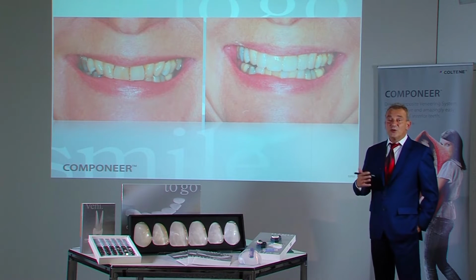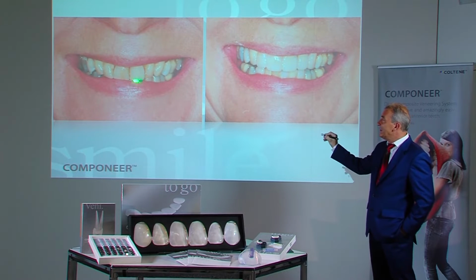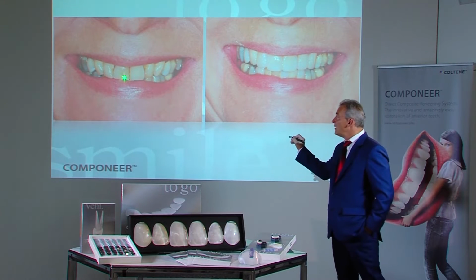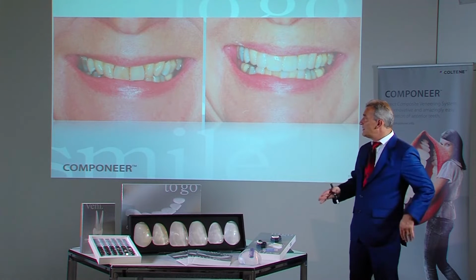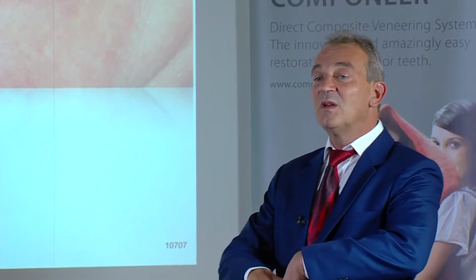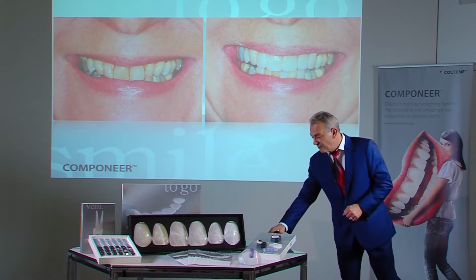This case also demonstrates a slight imbalance, although correlation of the occlusion line to the upper lip is not that bad, really. However, false coloring causes an imbalance. In addition, the anterior teeth are relatively steep due to the old fillings next to the central incisors, and the dental arch is not round. This can be demonstrated by the diagnosis in this case.